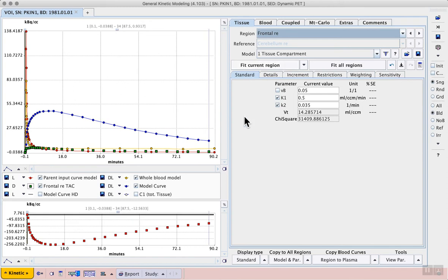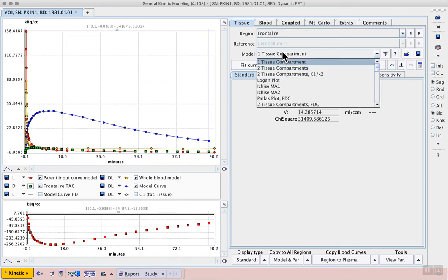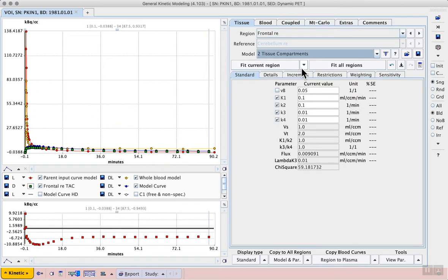Next we should select the model that we want to work with, so change the model selection from one tissue compartment to two tissue compartments.